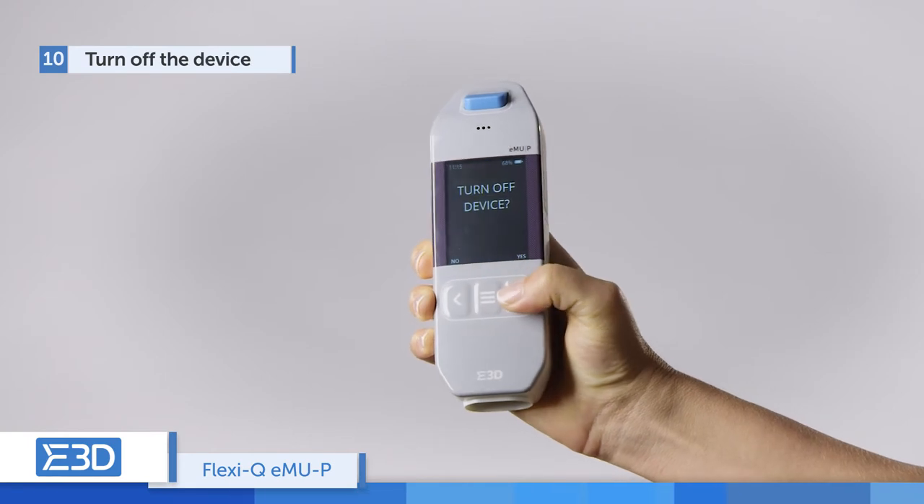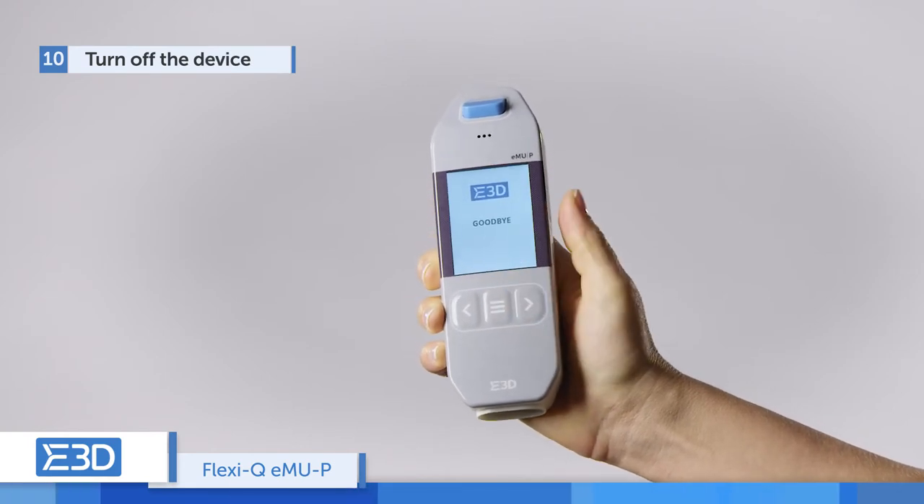Dispose of the cassette in a sharps container. Press the middle button to turn off the device. The device is ready for its next injection.